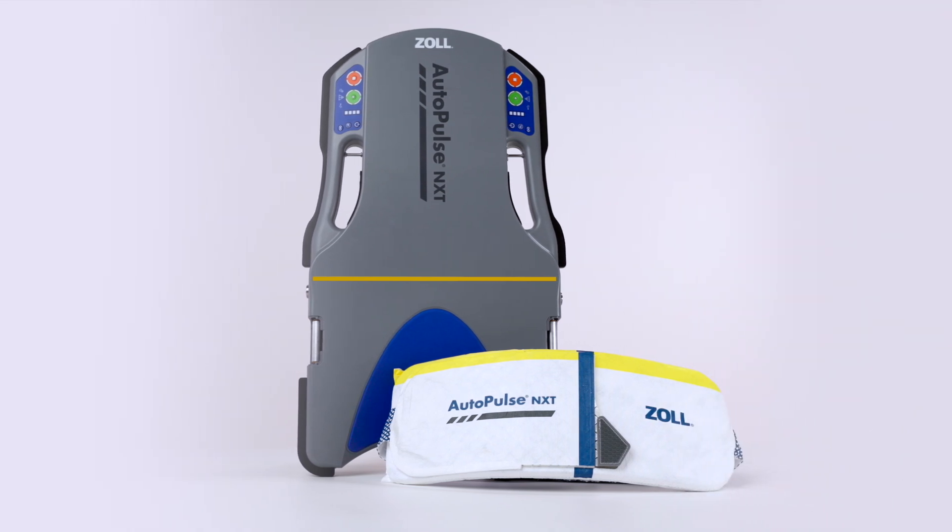We will explore the device's functionality and how to prepare AutoPulse NXT for use in the other modules in this series.